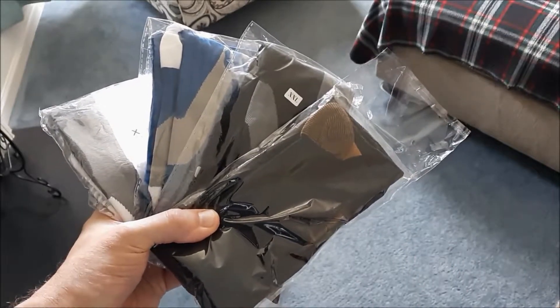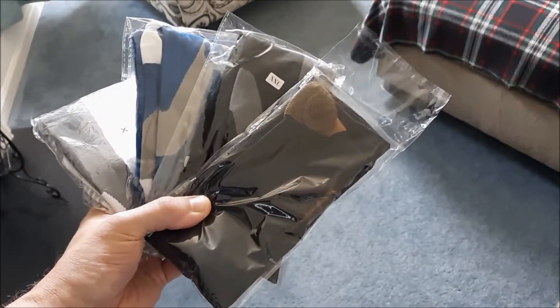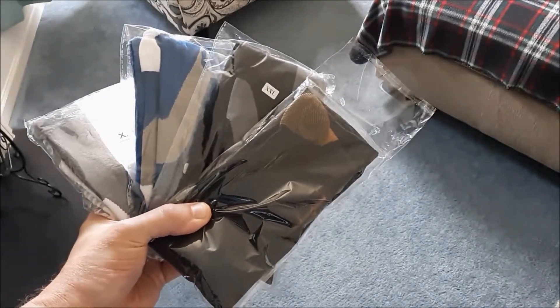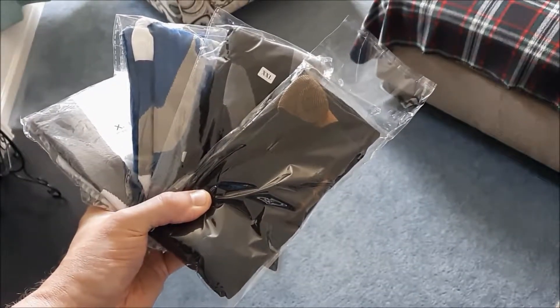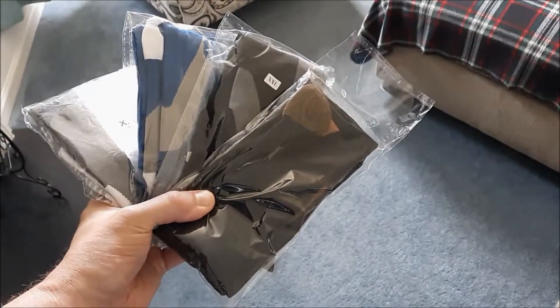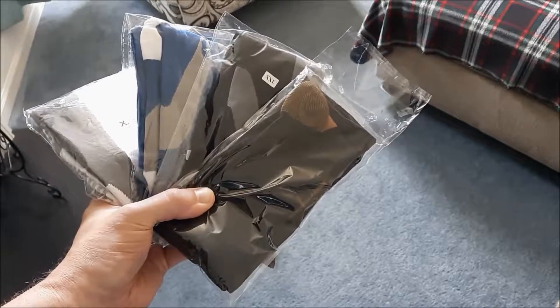The ones you get from the insurance companies are way too expensive, so I thought I'd try some of these cheaper ones that you can get on eBay, Amazon, and some other smaller sites. They usually run about $5, $6, $7 a pair versus some of the real expensive ones that can go up to $35 or $40 a pair.